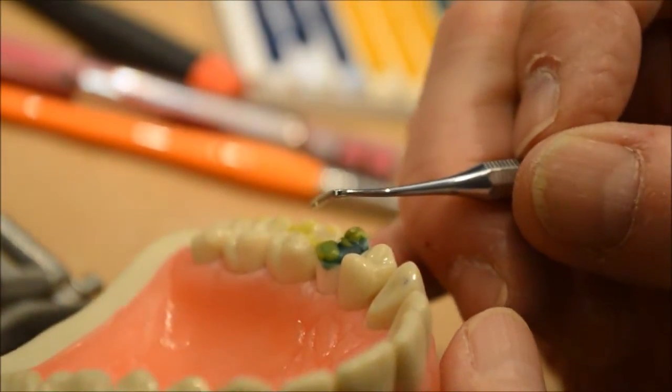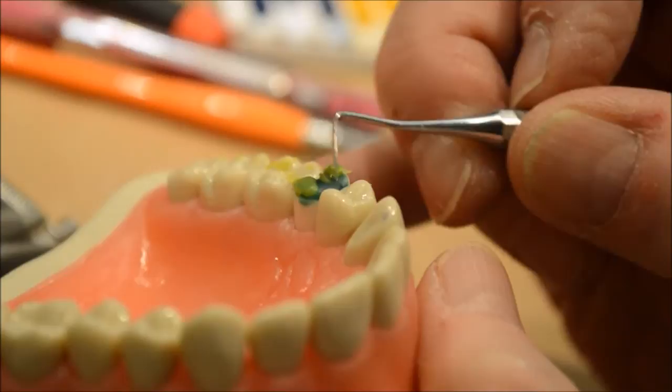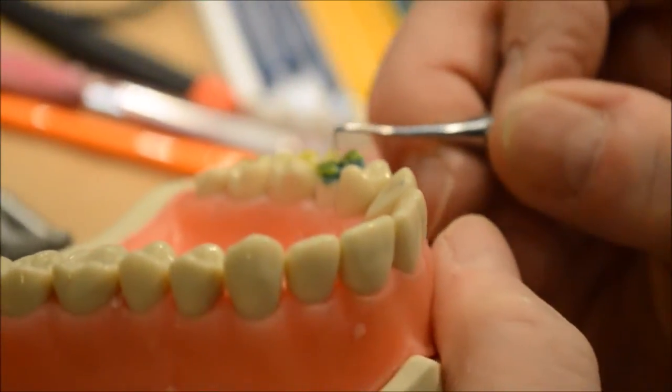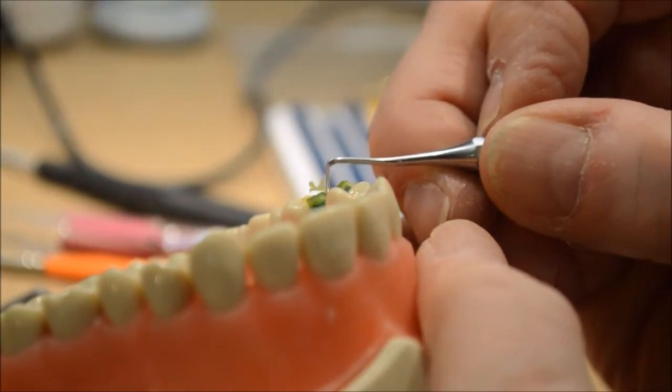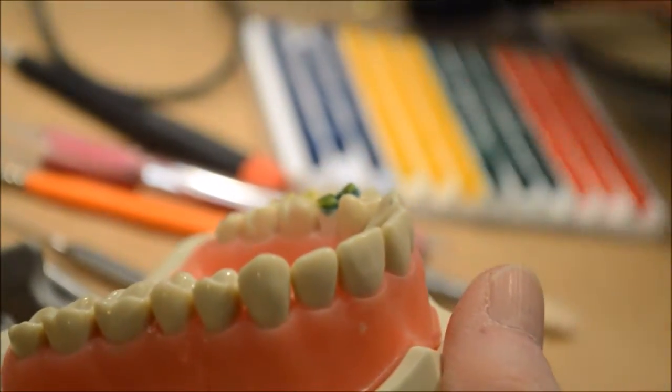I'm looking at it down to these three cusps with one eye to make sure this is not too high — by 'high' I mean too long. Same with the lingual — I think we can make it a little longer.